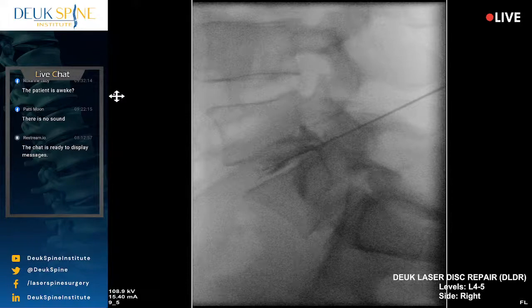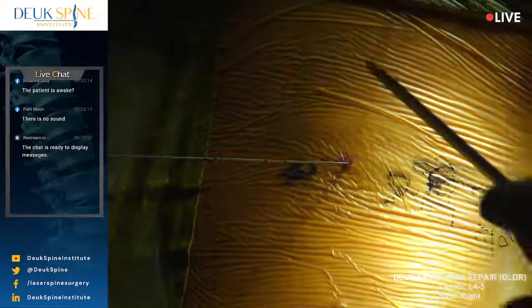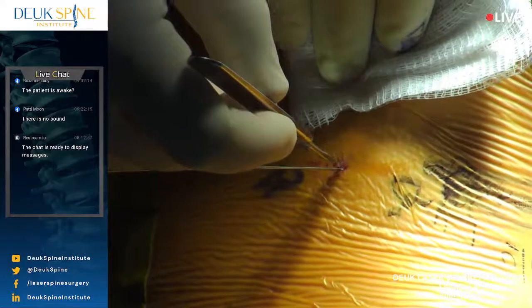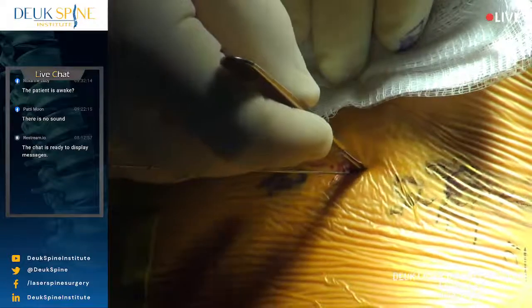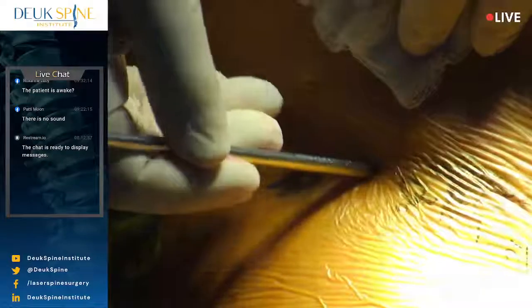So we're not going to cause any new injuries, unlike other types of surgery like microdiscectomy and laminectomy, where you're actually damaging the spine and the muscles and everything just to get to the disc. We're not damaging anything. The only damage we're doing to his body is this right here. It's a 7mm incision in the skin. We make a little cut right where we numbed up, and it's literally a 1/4 inch incision. And through that little incision, the whole surgery will be done. That's the beauty of this transforaminal technique.